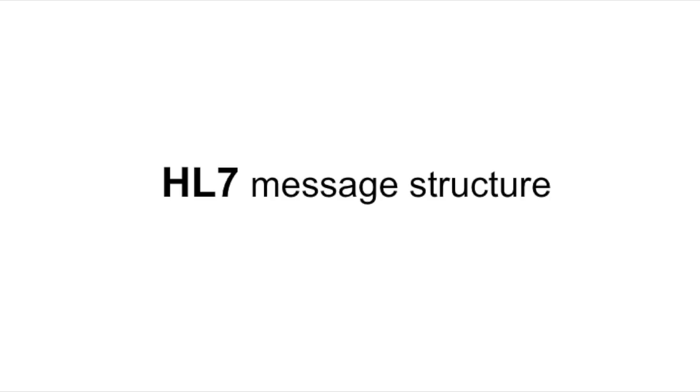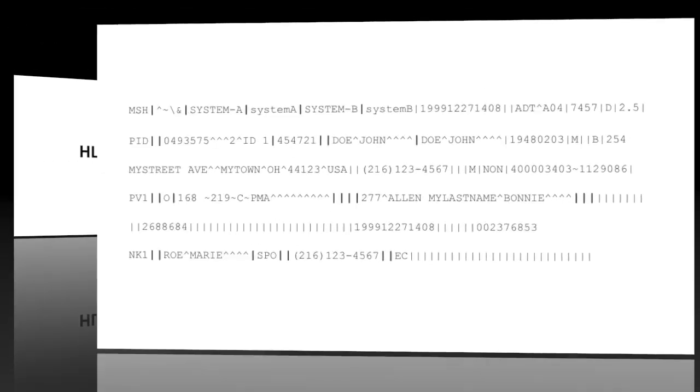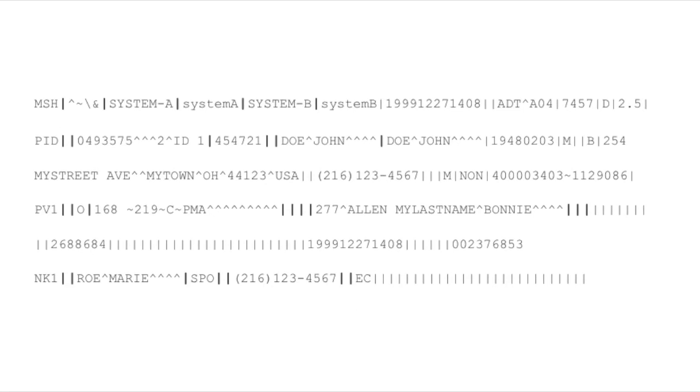Hi there. As introduced before, in this video we will take a close look at HL7 message structure. So let's start. Here we have an HL7 message, and as you notice, it's a pipe-delimited text.